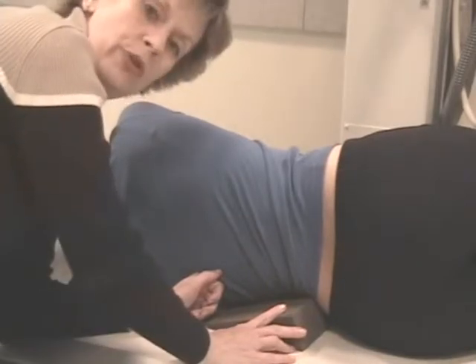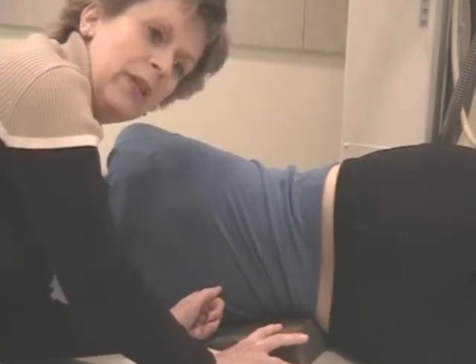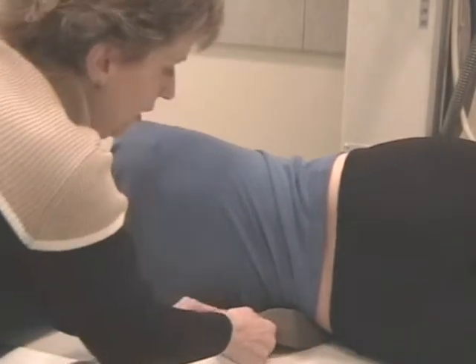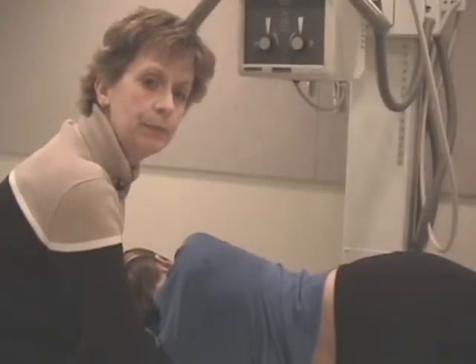Then you could keep your tube perpendicular. You could tell that it was not easy for me to slide this sponge underneath the patient. And believe me, a patient in pain, it would be even worse. Okay? So a lot of techs will not build the patient up on a sponge. More techs will choose to angle the tube caudal to maintain that relationship. And I mentioned if her curved spine, I would go 5 to 8 degrees caudal.